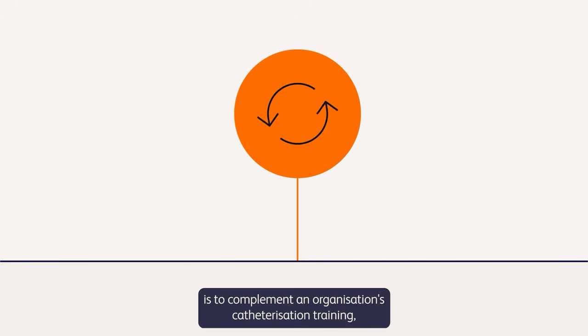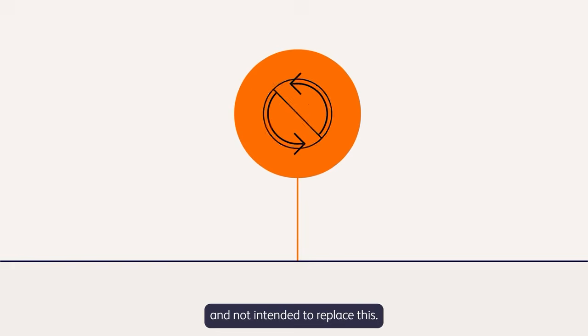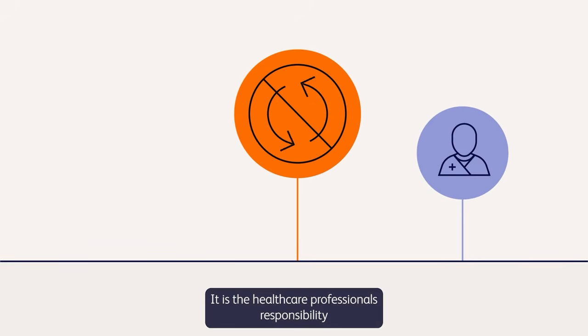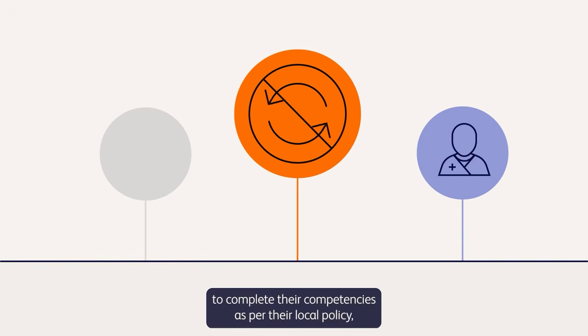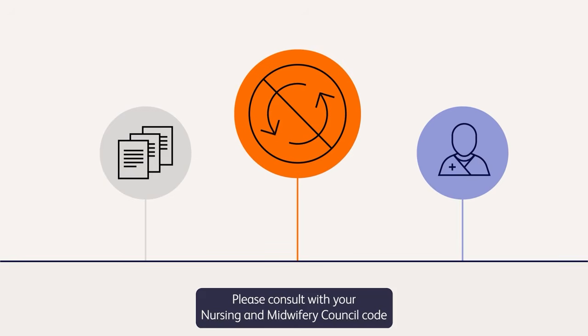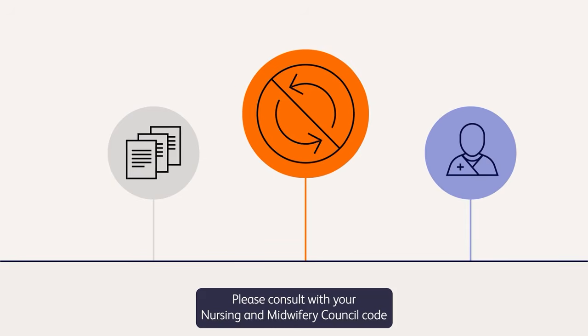This video on catheterization using the Foley tray is to complement an organization's catheterization training and not intended to replace this. It is the healthcare professional's responsibility to complete their competencies as per their local policy and seek support and guidance as required. Please consult with your Nursing and Midwifery Council code.